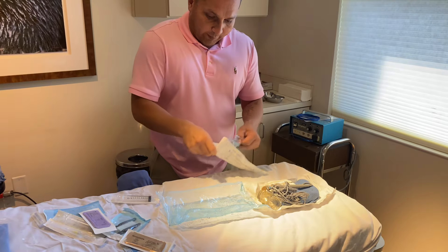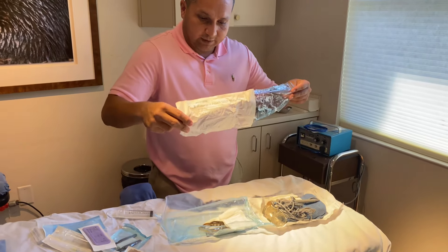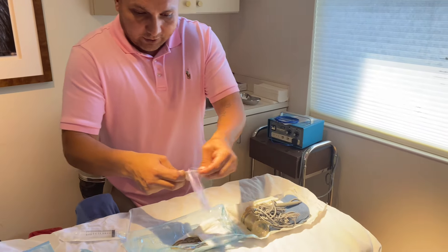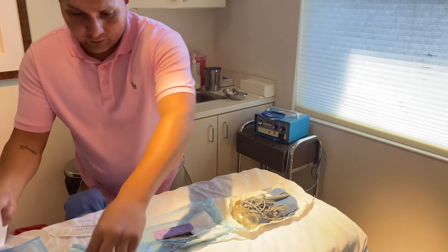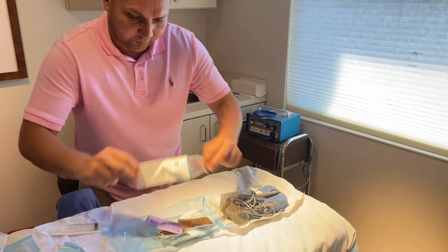What I do is I'll build this instrument set, and just like setting up vasectomy sets, just slide it in there — still sterile. You can put items in any order you like; it doesn't really matter what order. Just make sure everything is inside this sterile field.